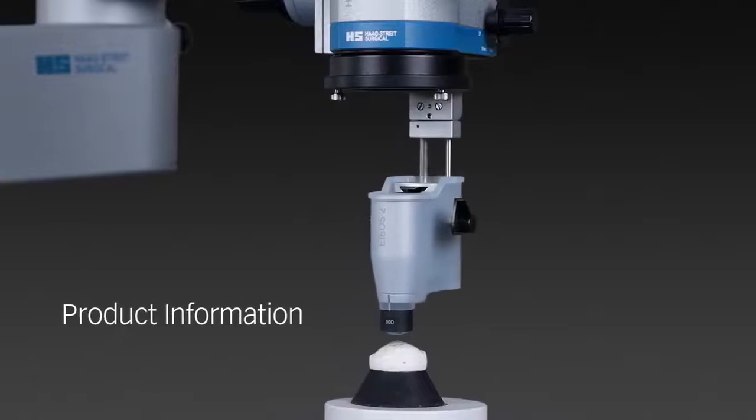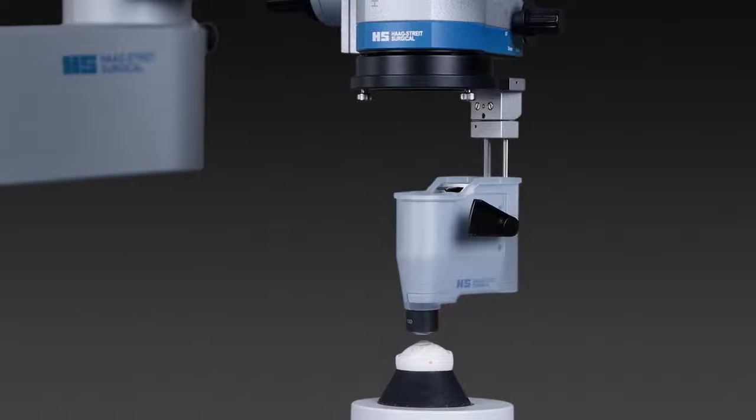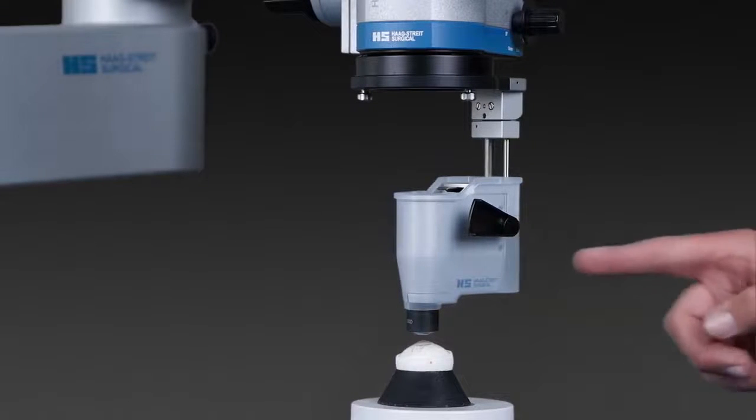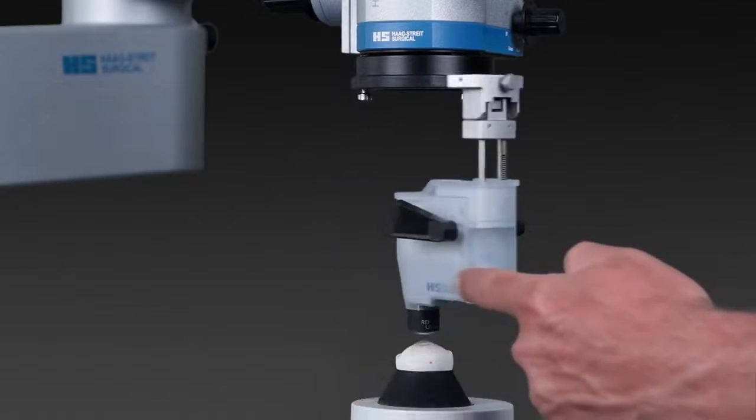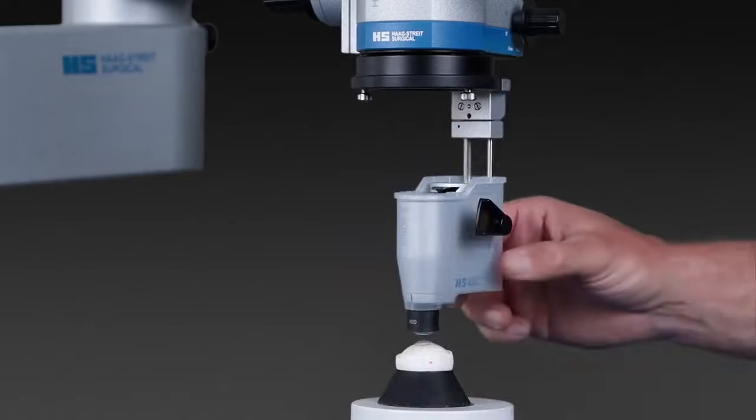The EIBOS 2 is a fundus observation system for intraoperative posterior segment viewing. The inverter body is very slim, which allows the surgeon at low magnification to simultaneously visualize the fundus and the incision area.